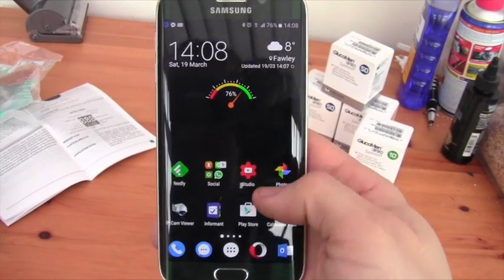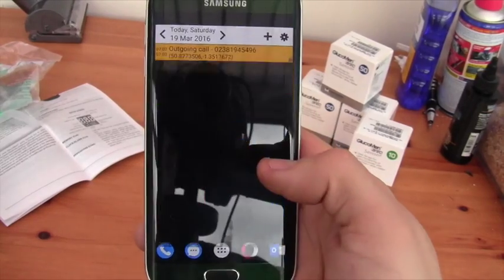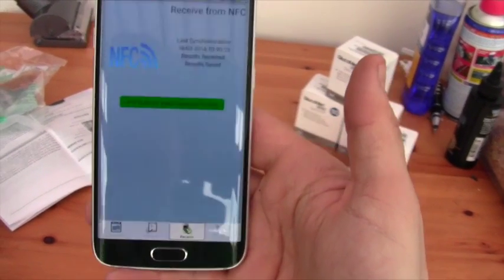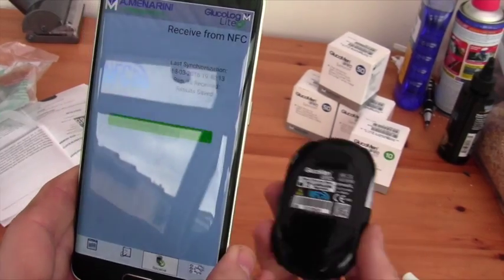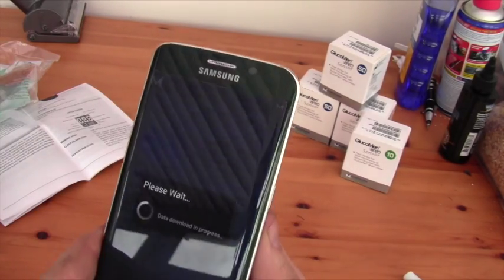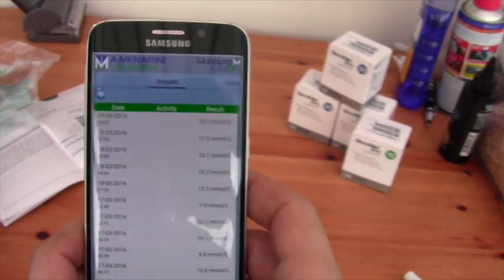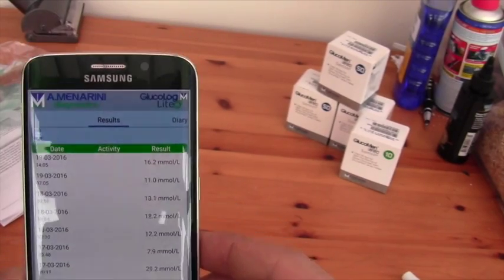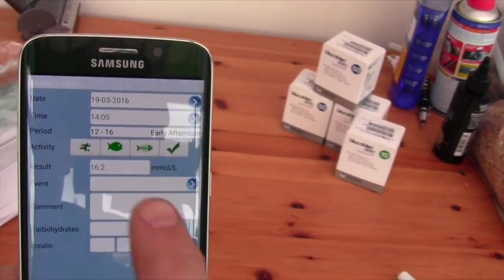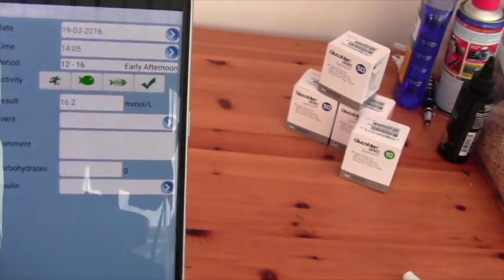The most interesting thing for me is that you can literally install the GlucoLog Light software, click on the download results button, and literally hold your meter to the back of your phone — there it goes, it's downloaded results, as easy as that. You can then go across to your logbook, and there is my last reading at the top. You can add markers here if you want, and you can add insulin intake if you want.